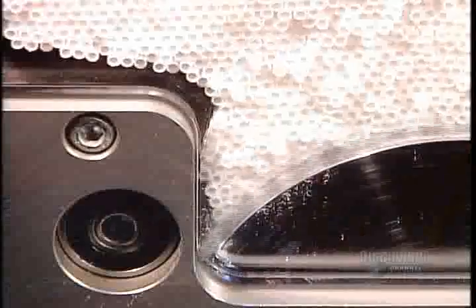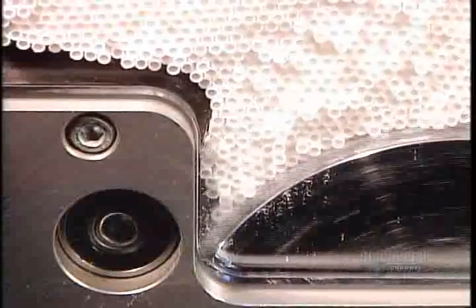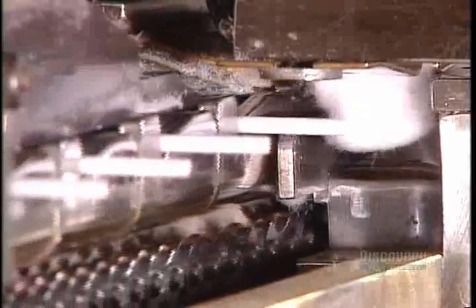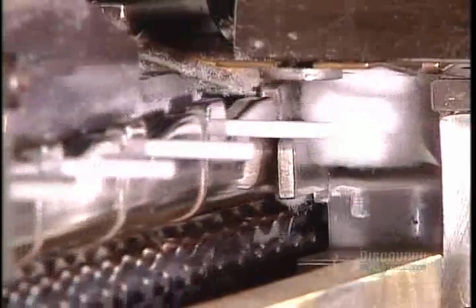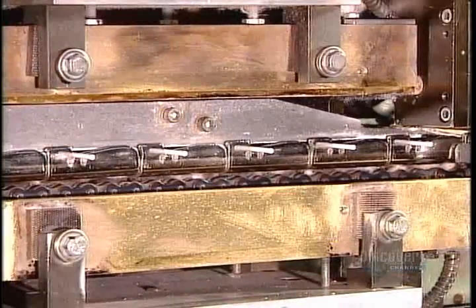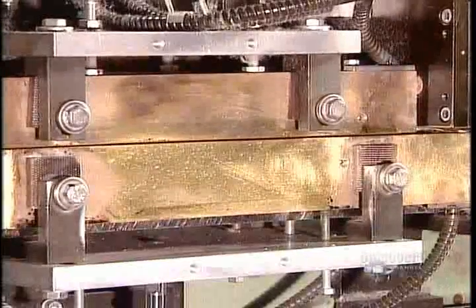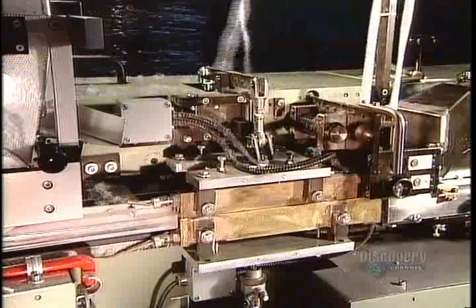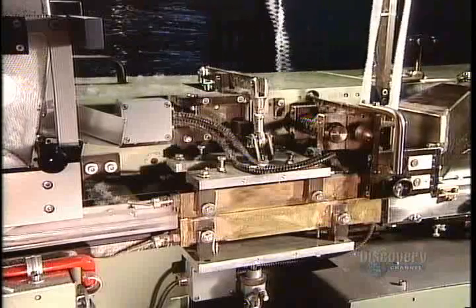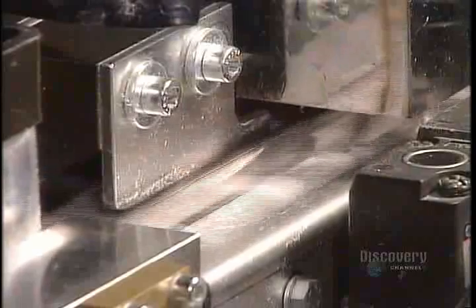The stick feeder prepares the sticks. Then, as we see here in slow motion, the machine cuts the cotton strand and rolls a piece onto both ends of the stick simultaneously. Just prior, a heating device melted the tips of the plastic sticks so that the cotton would adhere. With wood or cardboard sticks, they glue the cotton on.